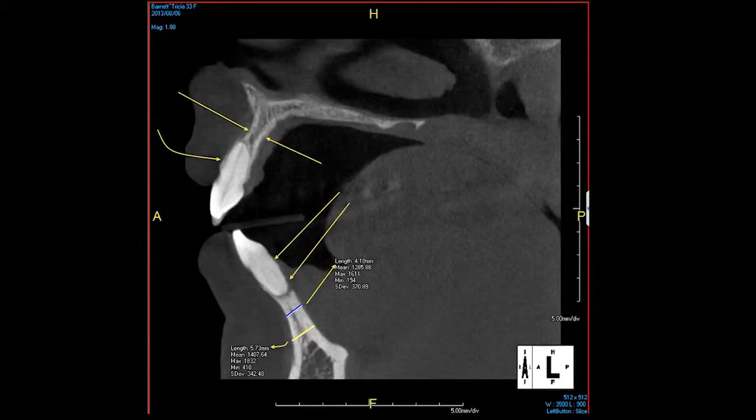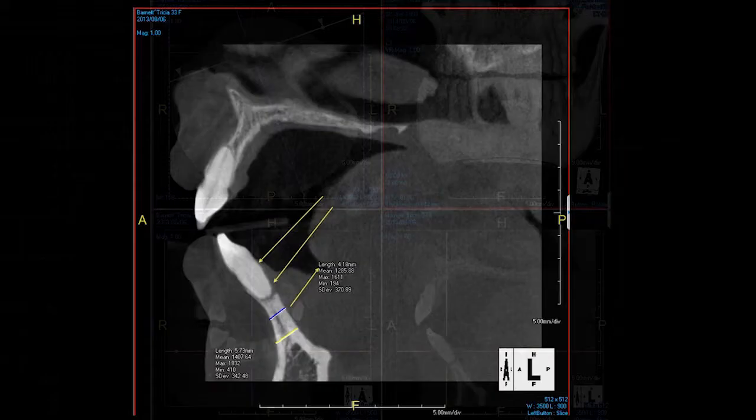Look at this one. This lady's 6'3". It's a black woman who came to see me for something. She's big. I mean, her face is big. It's almost as big as yours. I mean, it's a big old head. And look at this bone. I told her, man, you better take good care of your teeth, because if you lose them, you're going to be up a creek. But without the scan, I have no way of even imagining that this is what this looked like underneath.